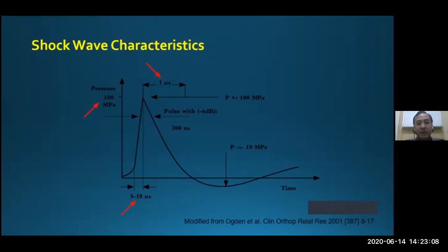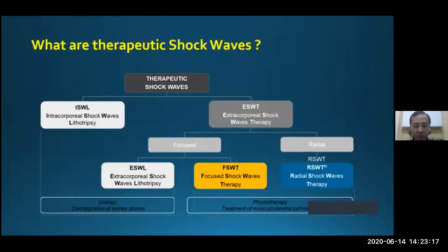So what are therapeutic shockwaves? Actually, we know that therapeutic shockwave is divided into two: intracorporeal shockwave lithotripsy and extracorporeal shockwave therapy.